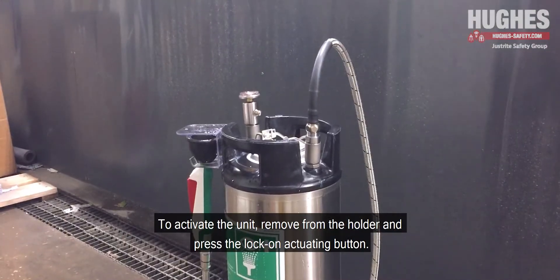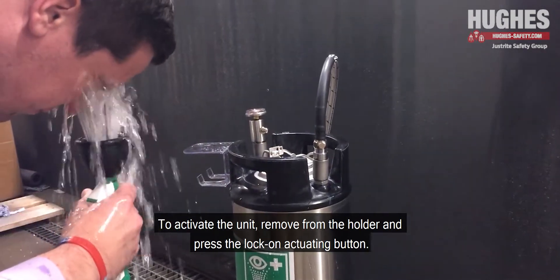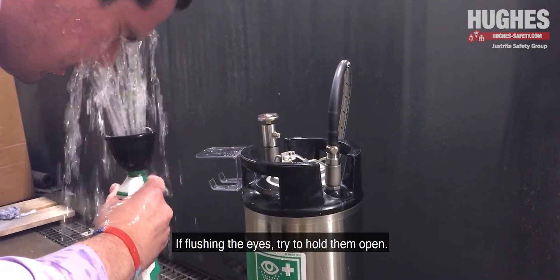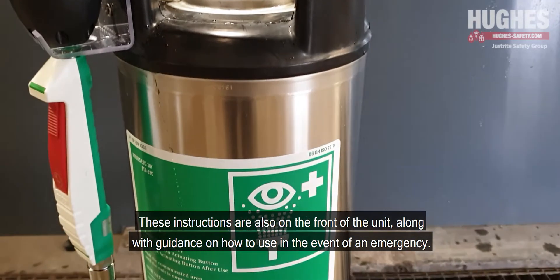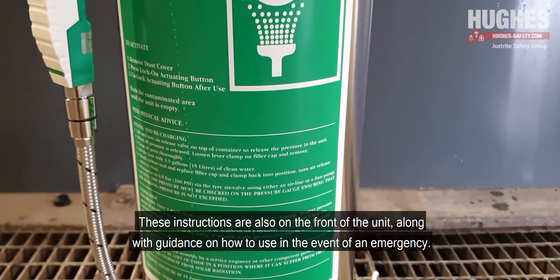Your unit is now ready to use. To activate the unit, remove from the holder and press the lock on actuating button. Use to flush the affected area. If flushing the eyes, try to hold them open. These instructions are also on the front of the unit along with guidance on how to use in the event of an emergency.